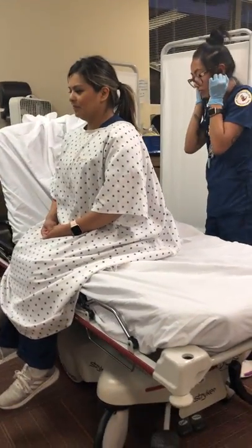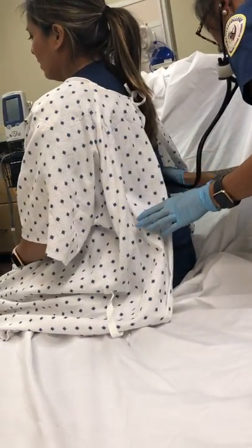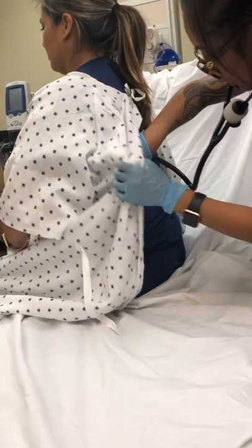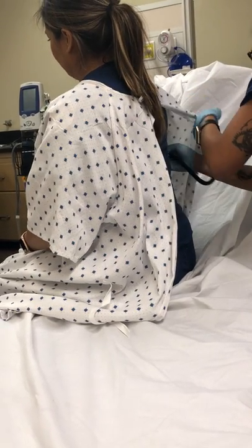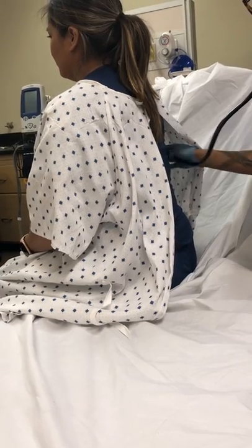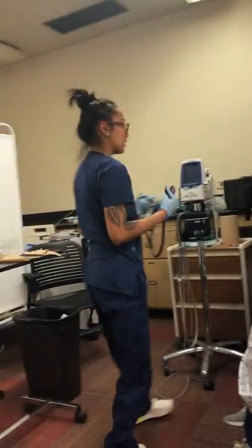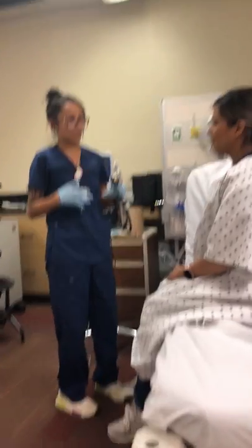I'm going to do the sides now, comparing each side. I'm going to go up a little bit and continue comparing. How are you feeling? Okay, no lightheadedness or anything. On the back, I did hear some wheezing at the bases. I'm going to also double-check and confirm it in the front as well.